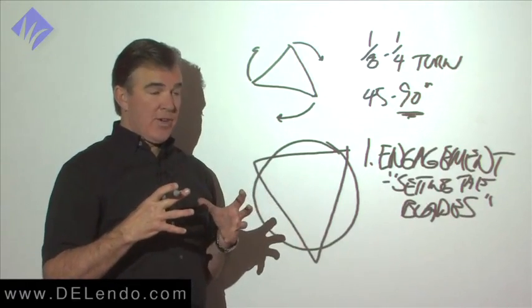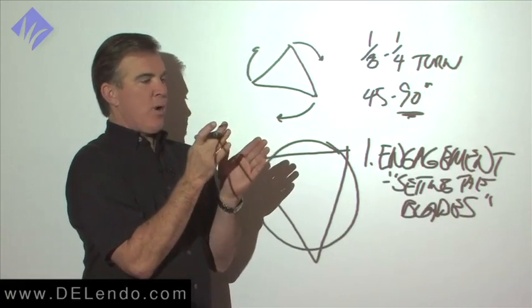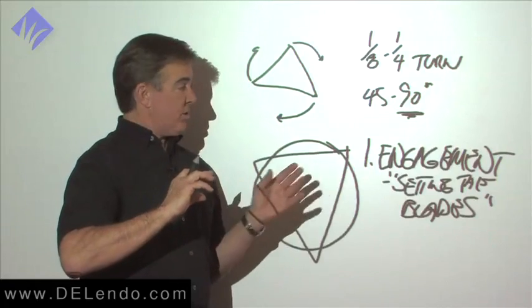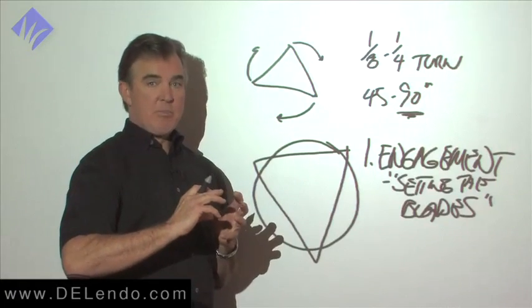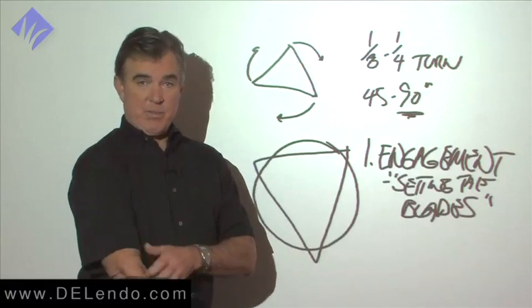When I activate this file, which is in the engagement stroke, I'm going to look very carefully at the stop and the reference point or any sight line I need, and I'm going to make sure that when I do the engagement stroke, the file physically moves into the canal. If it doesn't move into the canal, I need to get it out of there and do something different.